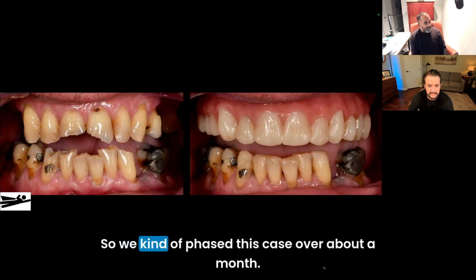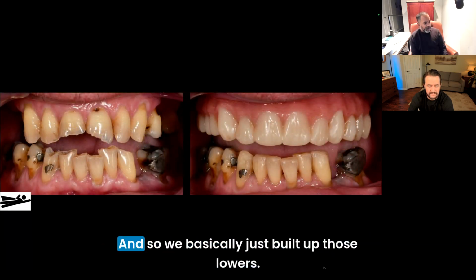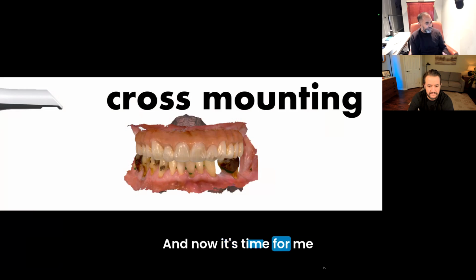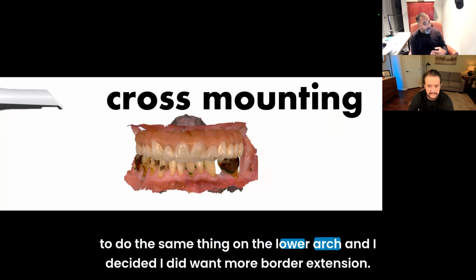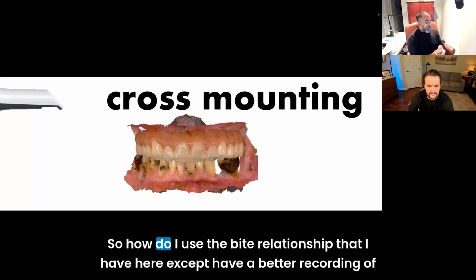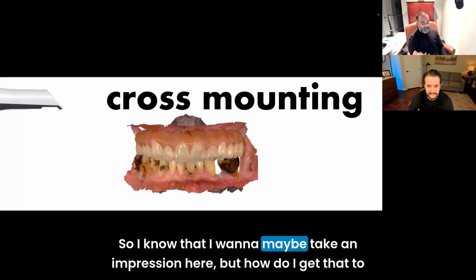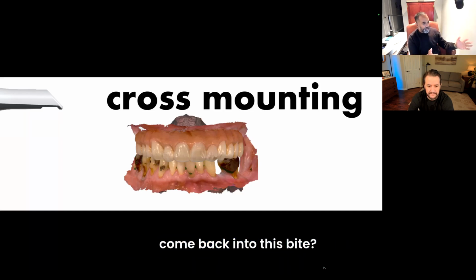So we kind of phased this case over about a month, and so we basically just built up those lowers. The patient acclimated to the upper arch, and now it's time for me to do the same thing on the lower arch, and I decided I did want more border extension. So how do I use the bite relationship that I have here, except have a better recording of the lower arches? So I know that I want to maybe take an impression here, but how do I get that to come back into this bite?